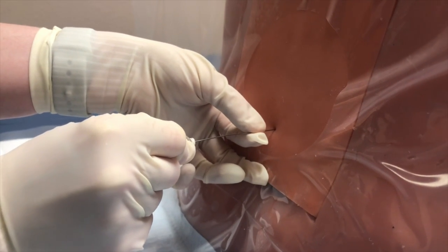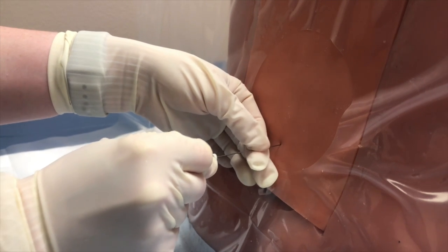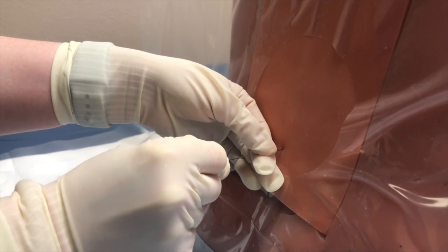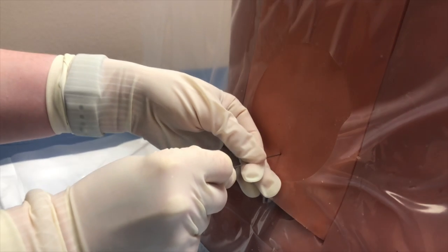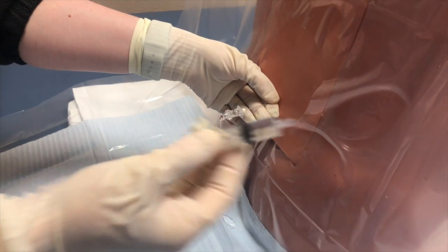As the tip of the needle passes through the ligamentum flavum, some compare this sensation to when a needle passes through a pencil eraser. As the needle passes through the dura, the anesthesia provider may sense a pop or a click.